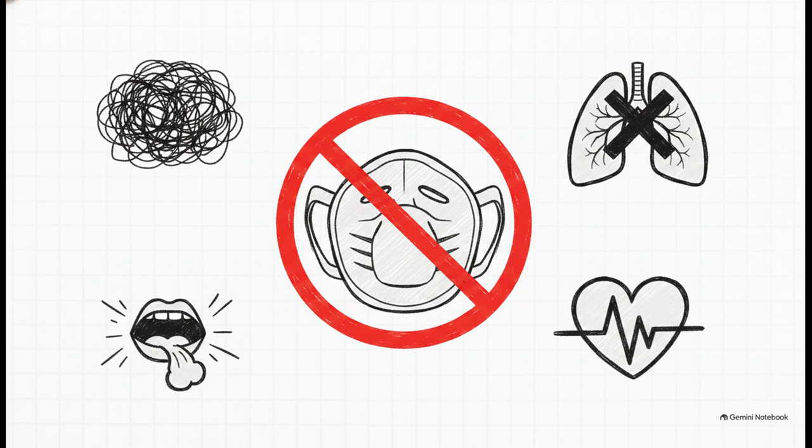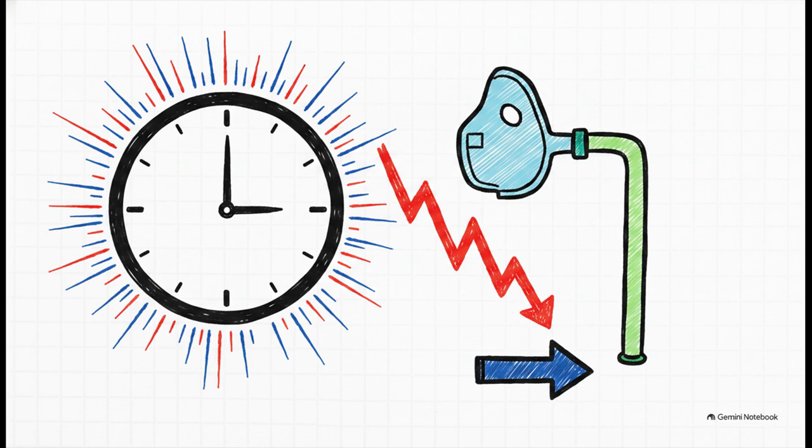Likewise, if they're hemodynamically unstable or already in respiratory arrest, you don't have time to trial a mask. They need immediate, definitive, invasive airway management. And that brings us to a really crucial warning.